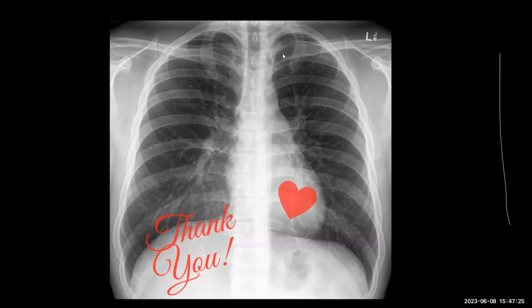But in all honesty, the dynamic MR scanners are usually built in a way in which the patient is scanned either in a sitting or standing position. The only trade-off is doing it in flexion, normal supine and extension positions if you have a normal MR scanner.